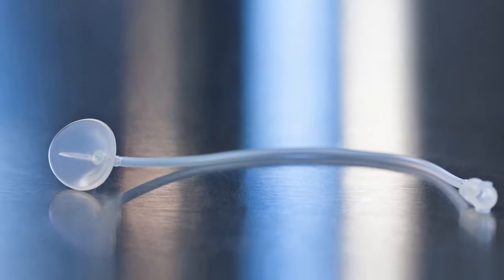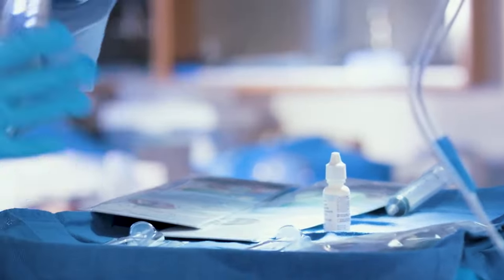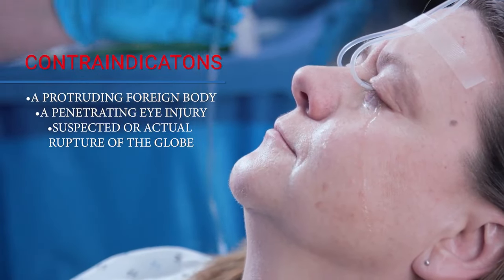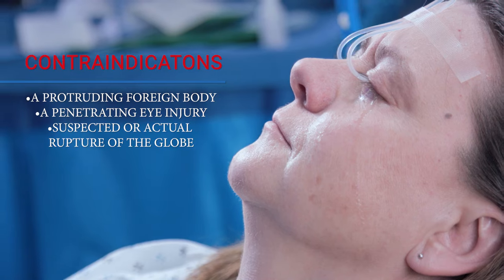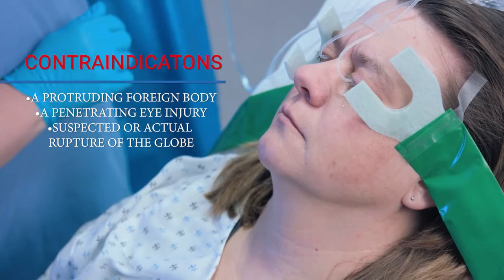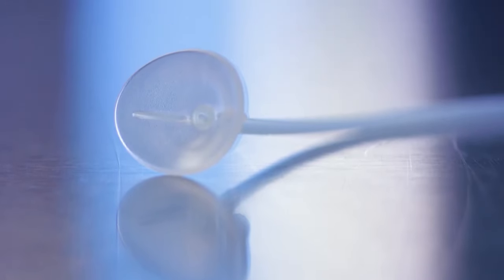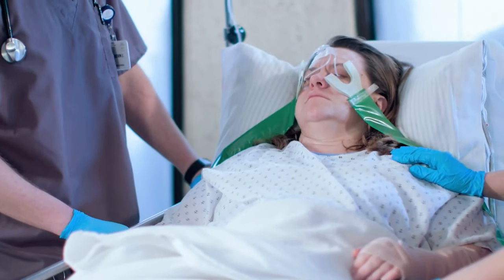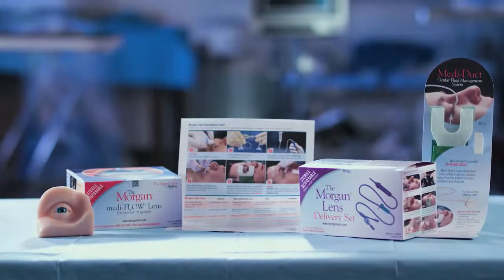Experts have said that regardless of the chemical involved, immediate and copious irrigation is most important. Contraindications include a protruding foreign body, a penetrating eye injury, or suspected or actual rupture of the globe. In all other cases, begin immediate irrigation and wait to perform a more detailed evaluation or history until treatment is underway.